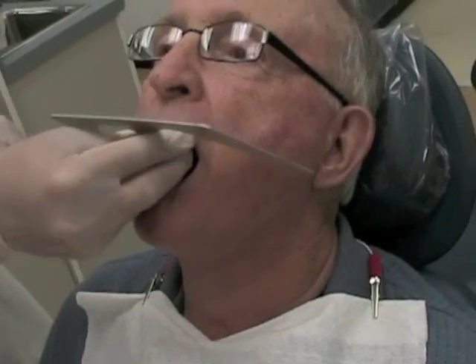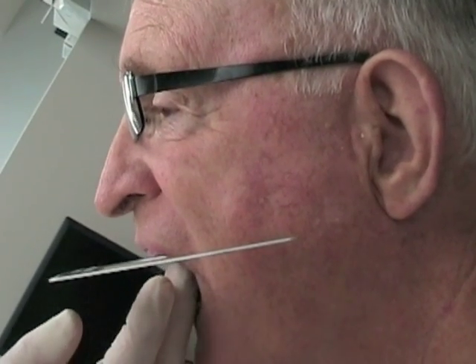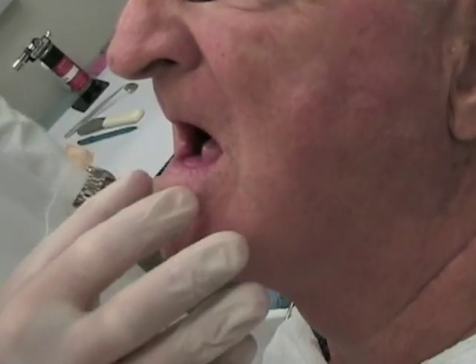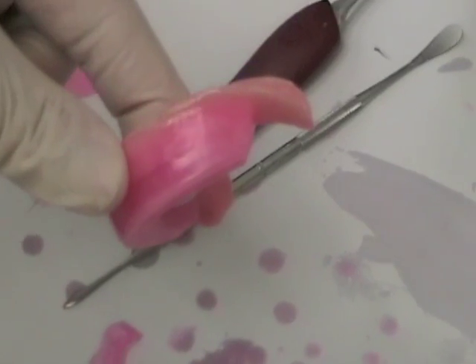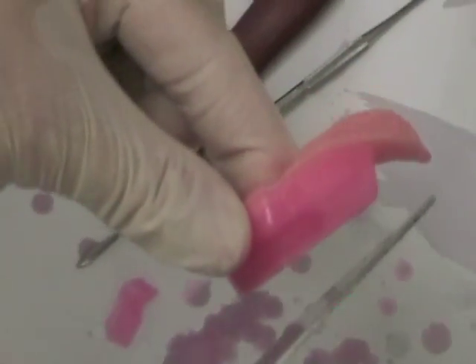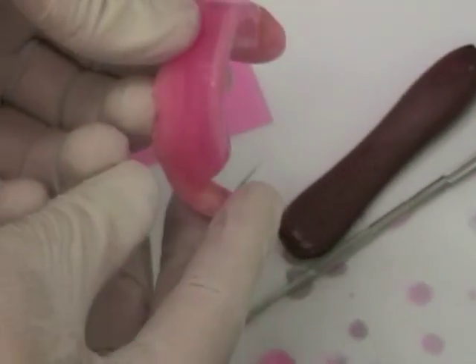A Fox plane is an instrument placed against the occlusal plane to ensure it is parallel to both the ala-tragus line (from the ala of the nose to the tragus of the ear) and the interpupillary line. Taking the patient's glasses off may make it easier to check parallelism to the interpupillary line. The mandibular rim should be adjusted using the same techniques, but remember it should be at the level of the corners of the mouth and intersect halfway up the retromolar pad. When using the wax former to melt and adjust the rims, hold the rim so that any melted wax drips away from the record base to avoid unseating it intraorally.